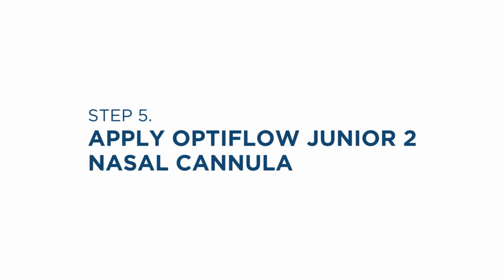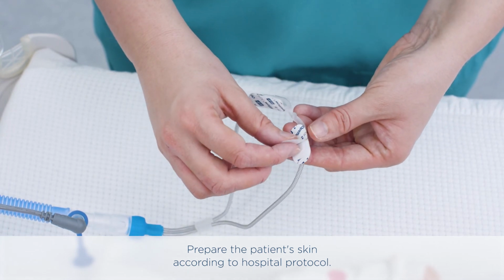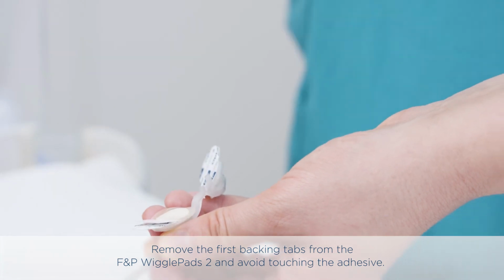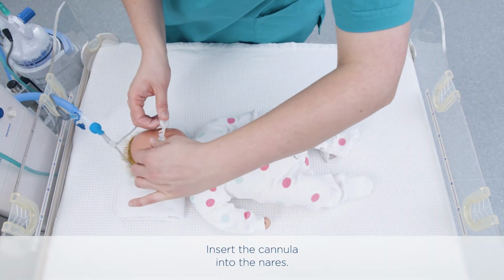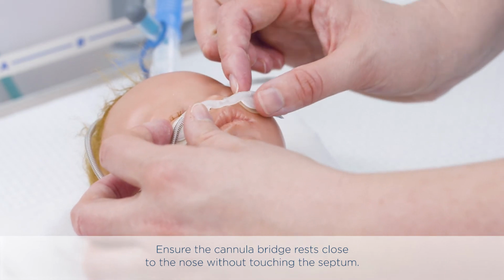Apply Optiflow Junior 2 nasal cannula. Prepare the patient's skin according to hospital protocol. Remove the first backing tabs from the F&P wiggle pads 2 and avoid touching the adhesive. Insert the cannula into the nares. Ensure the cannula bridge rests close to the nose without touching the septum.